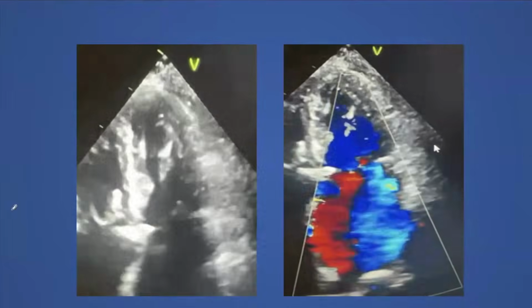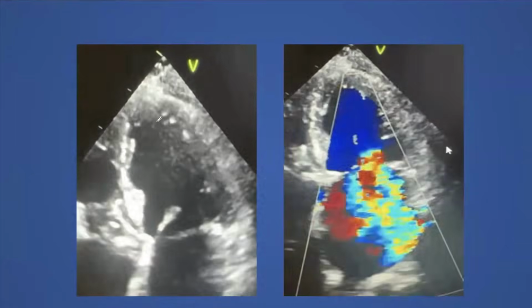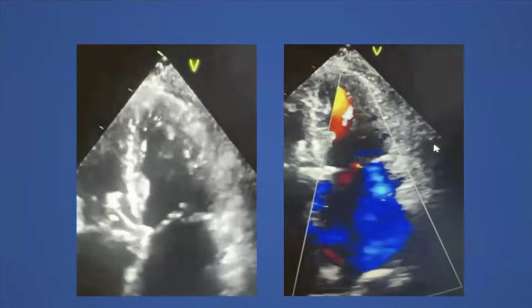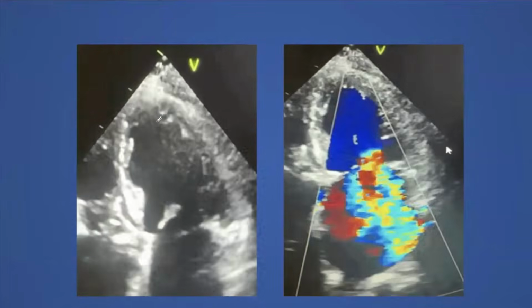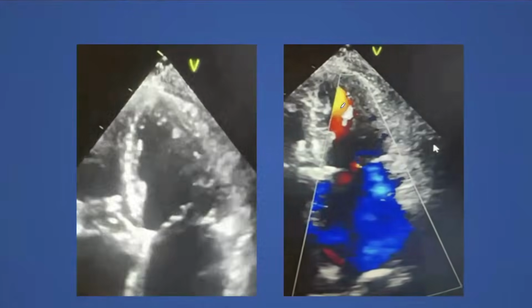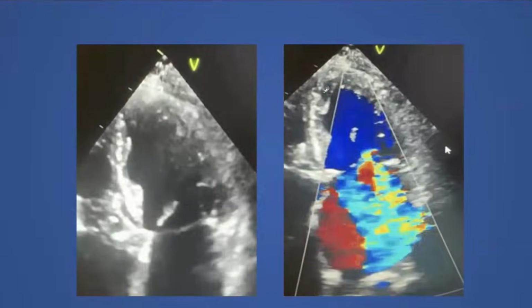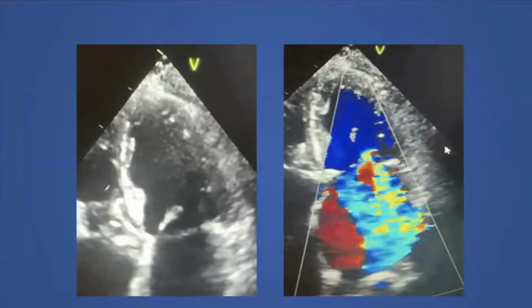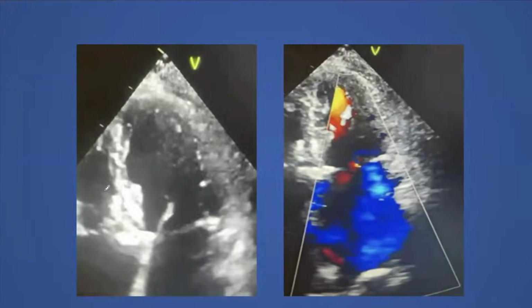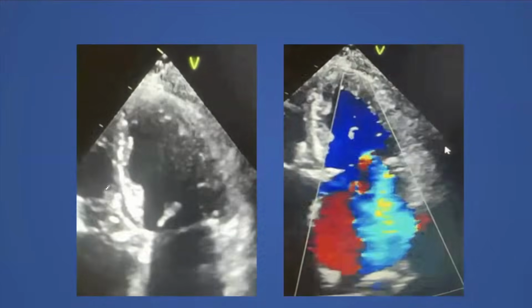When we did the echo, I noticed that the apex is relaxing vigorously in the isovolumetric relaxation time before the mitral valve opens. So it is the flow at this region that is detected. It is this flow. So this is why we have this wave. This is the only explanation, unless Dr. Kim or Dr. Chow have another and debunk my theory.